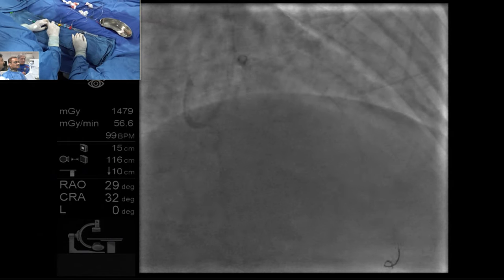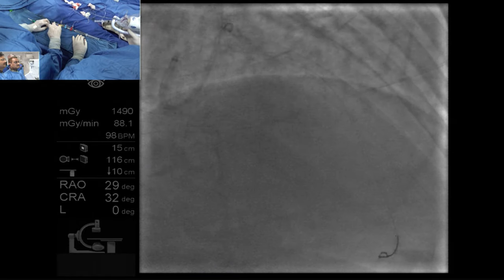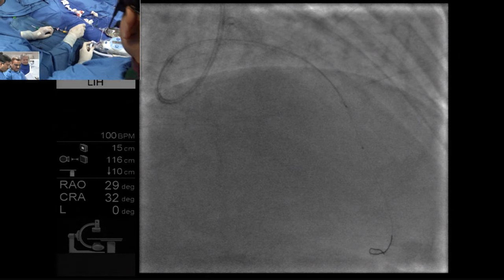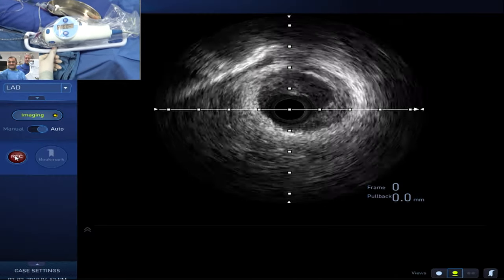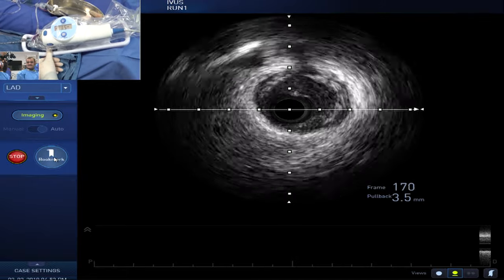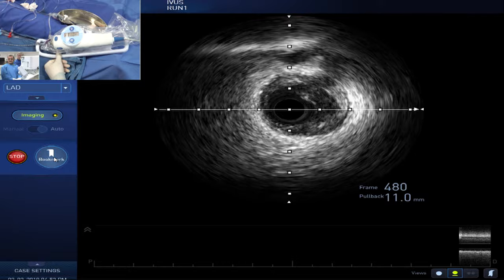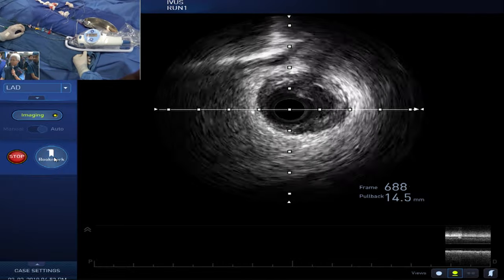That was a long time ago. I think once IVUS goes through it, there is no role for rotablation, in my opinion. You can just do the NC balloon and stent it. That is probably very true. There's still a lot of plaque here. Yeah, but it's not concentric, so it will give in one way or another, somewhere. About 50% here, no? Upper part is in the epicardial portion, right? And here, some plaque.